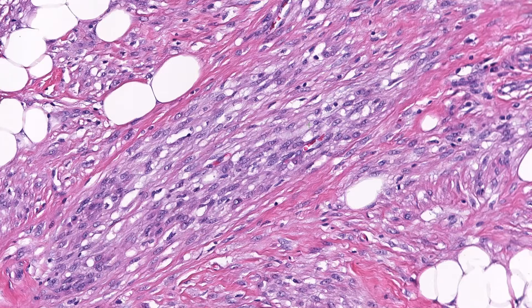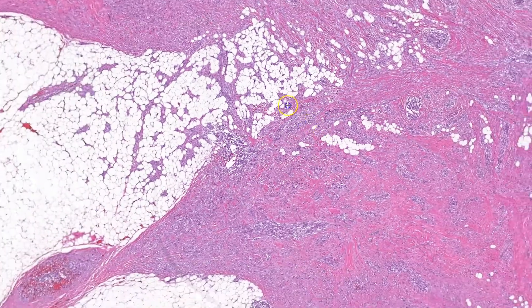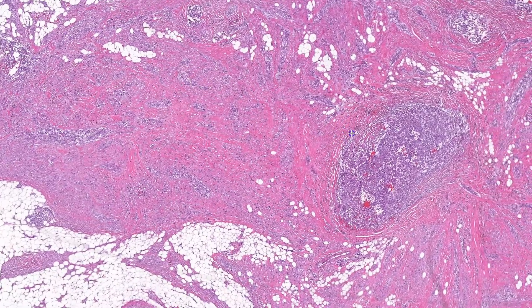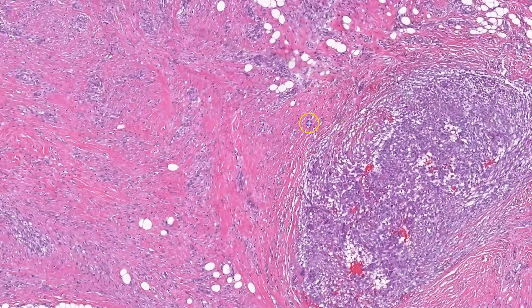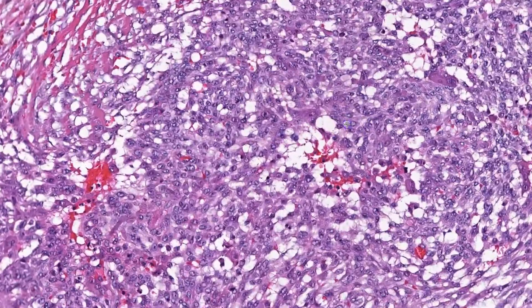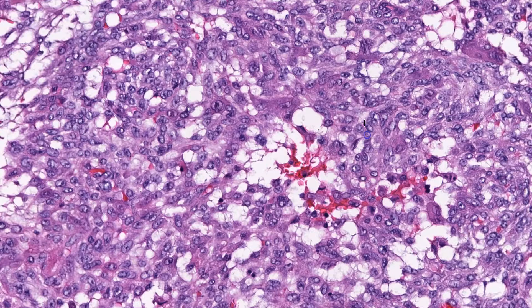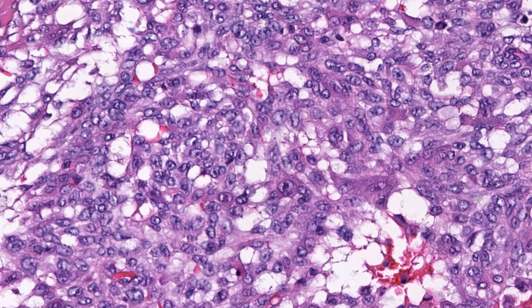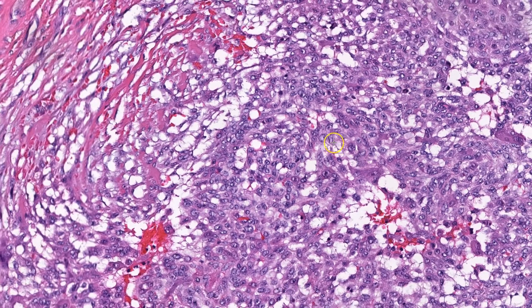The cytoplasm is pale and amphiphilic, and the cell borders are indistinct. In contrast, the nodular component is well-defined and composed of sheets of histiocytoid cells with similar nuclear features as the spindle cells.